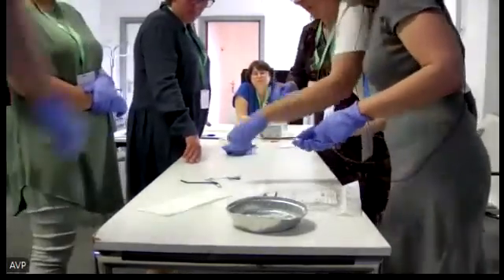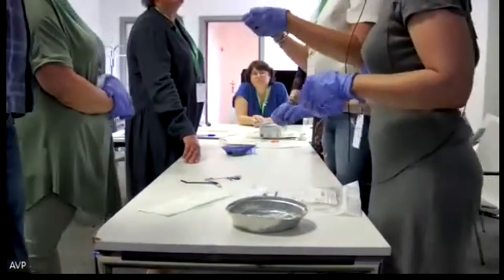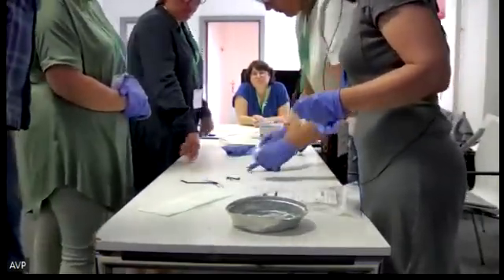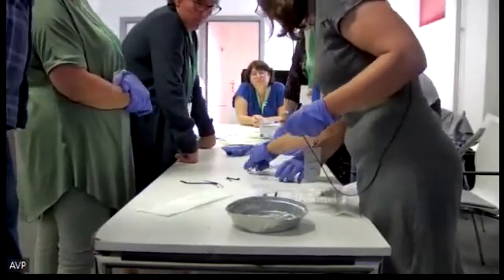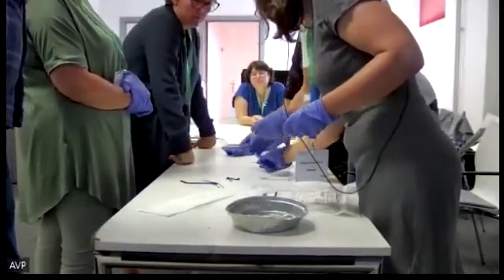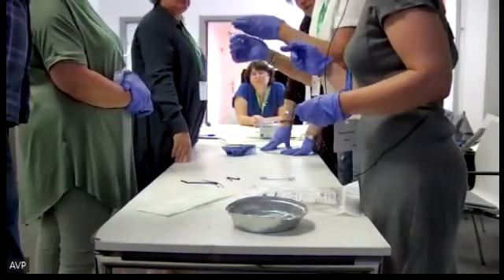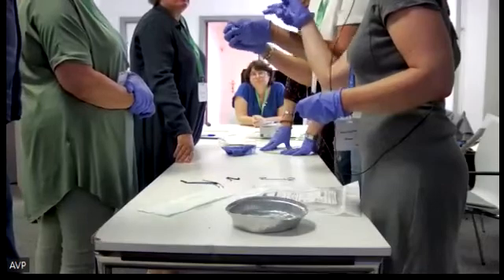So here, the story of the flaps. Before we had such a kind of pigtail stent. This part stays outside, in the duodenum.